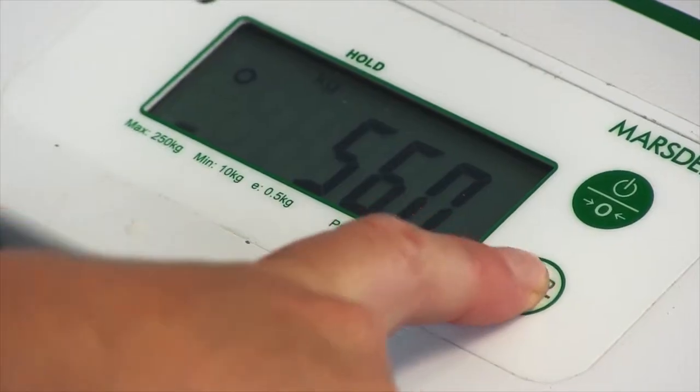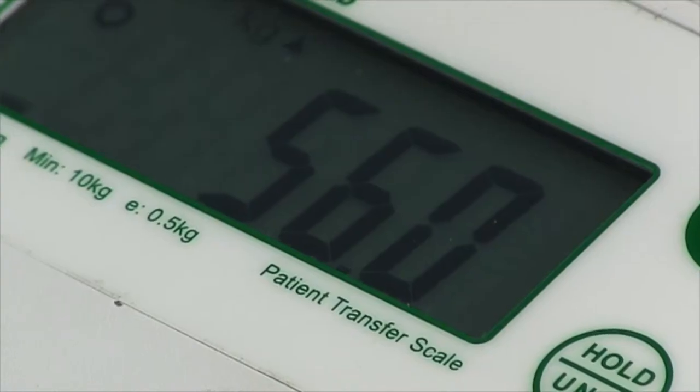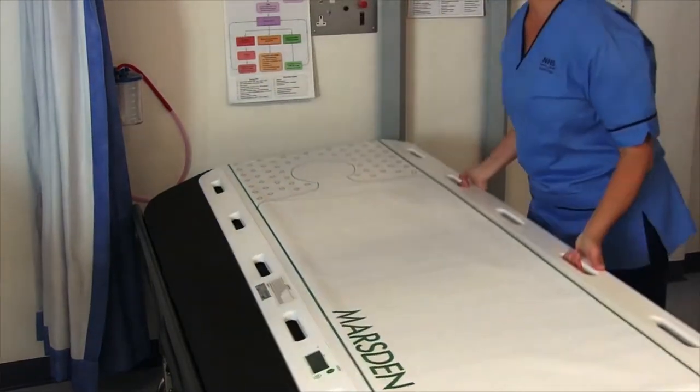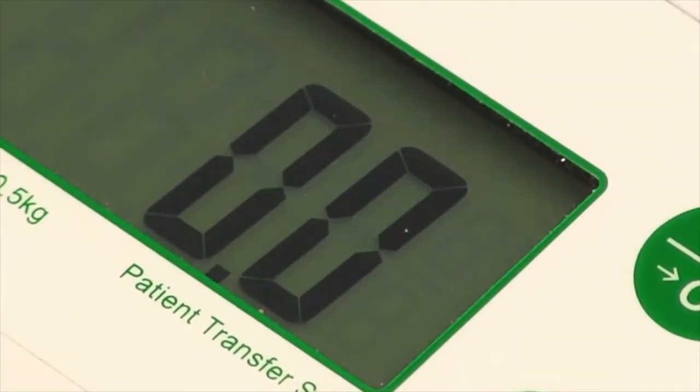It has a large clear weight display and there is a hold feature which stabilises the weight reading, making it even easier to get the patient's weight. Using the patient transfer scale is just like using a transfer slide, and it should be used in line with your current transfer policies.